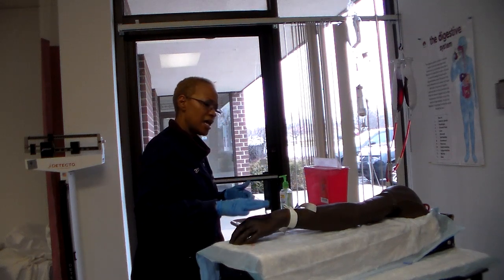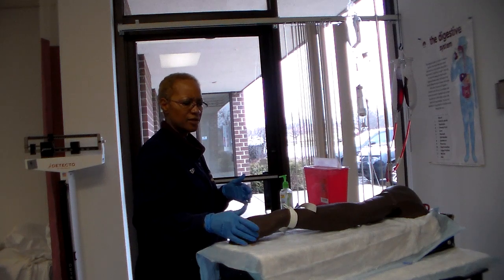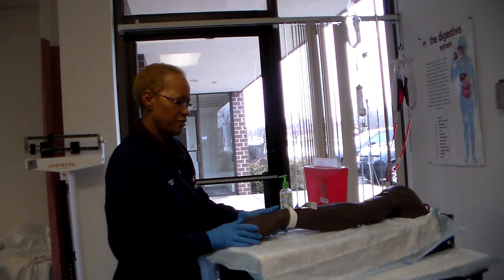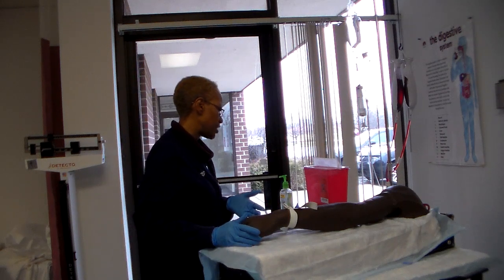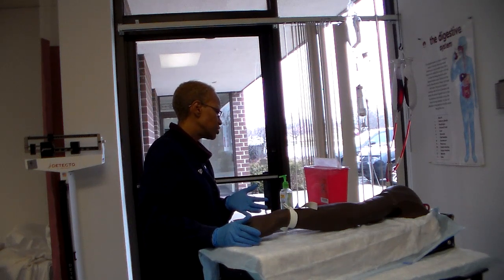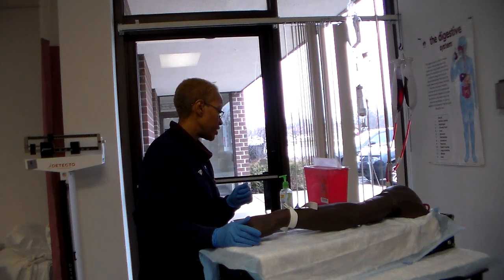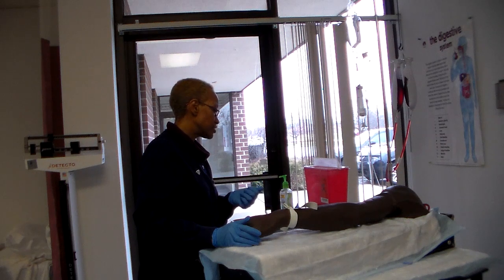Okay. And not to the point of pain. I see sometimes people apply a tourniquet so hard to the point of pain. It doesn't have to be to the point of pain. But about 4 to 6 inches above your site, because you don't want bruising or anything like that. If you have a very fragile client, you can even put this tourniquet over a thin layer of clothing to protect their skin.